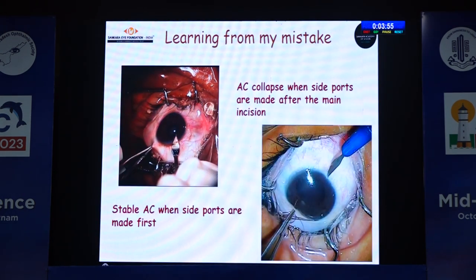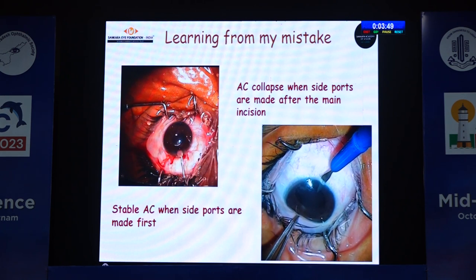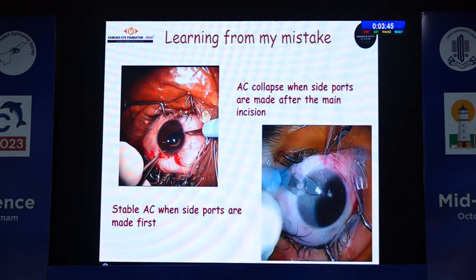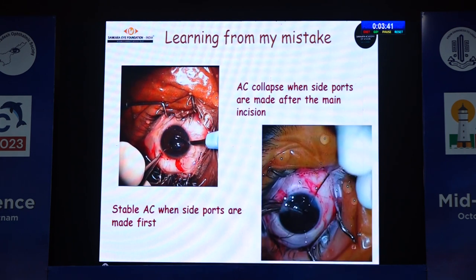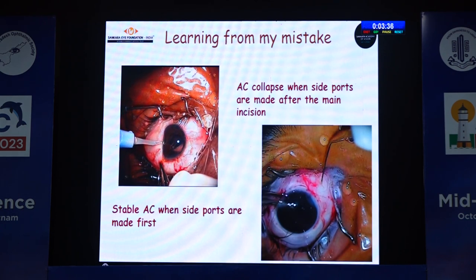What I learned from my mistake, especially in a vitrectomized eye: if we do the side ports first, before the main incision, the globe is very much stable. In my first video, the main port was done first, and when I later made the side ports, the eyeball was collapsing significantly.